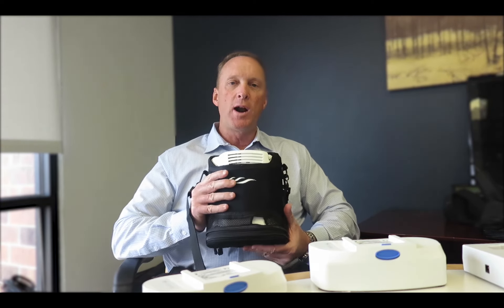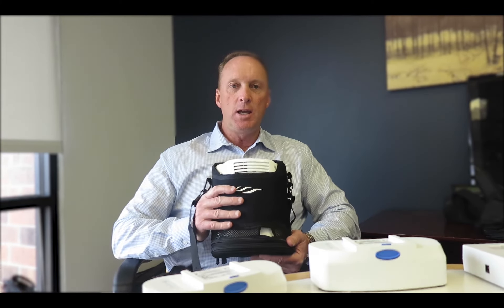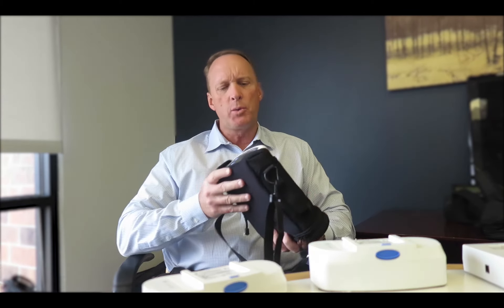The last piece for test mode is to understand how many hours are actually on the device. So you can go in and from a service perspective see how many hours the patient's used it. So those are the three key features.